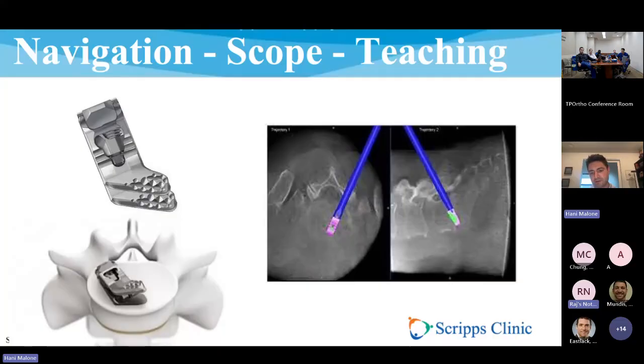When I was training, we would do it under our loops, and then you just use fluoroscopy to figure out where you are. But if you're doing it with your loops, you can't really see what your fellow is doing. I had this camera on my headlight, but it was so grainy, Fessler couldn't see anything that I was doing. It was just blind faith.